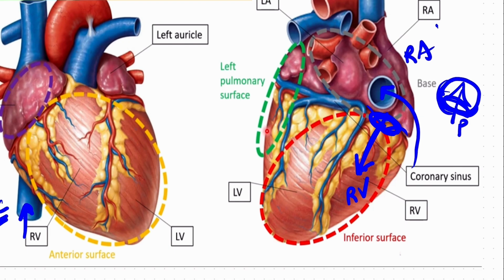And you extend this incision parallelly and laterally, 1 centimeter lateral to the posterior IVS and parallel to the posterior IVS. You extend this incision as far as you can till the apex. This is the inflow. From the inferior vena cava, enter into the right atrium. From the right atrium through the posterior tricuspid leaflet, enter the right ventricle, running parallelly lateral to the posterior interventricular septum, as far as possible till the apex.